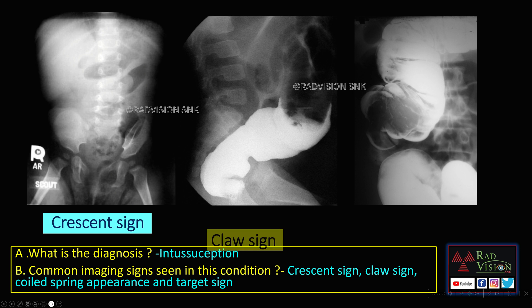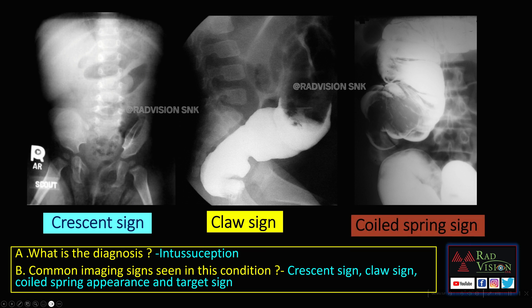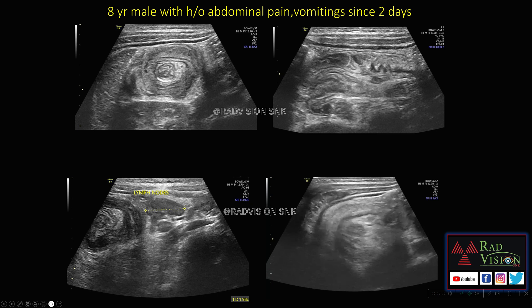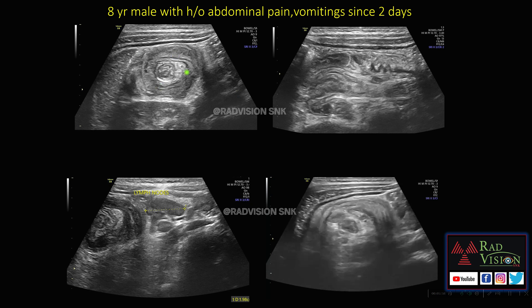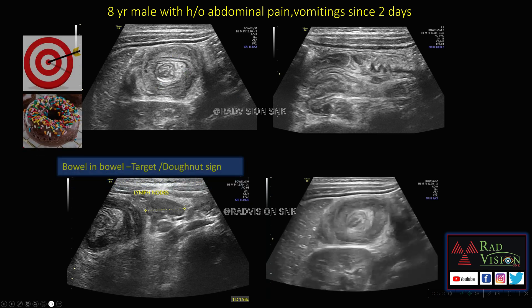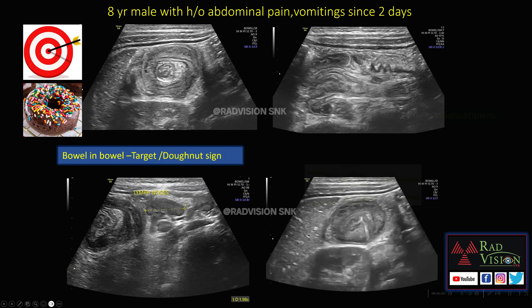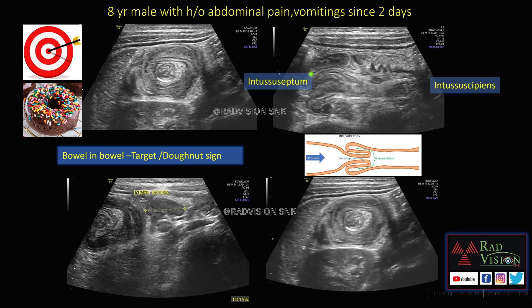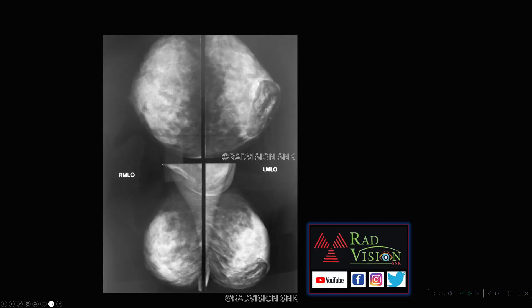On ultrasound, the other common appearance is bowel-in-bowel appearance, also known as the target appearance or donut sign. You can see the intussusceptum and the intussuscipiens. The lymph nodes are one of the causes of intussusception. So this is a case of intussusception.